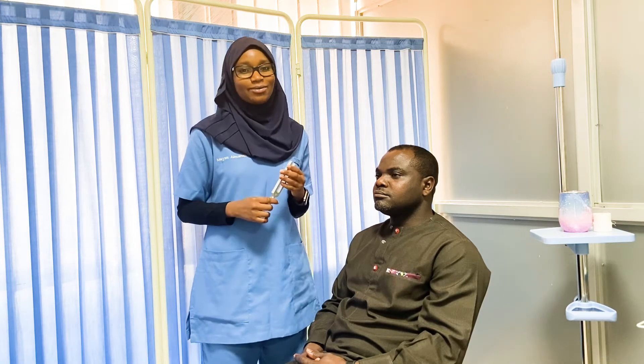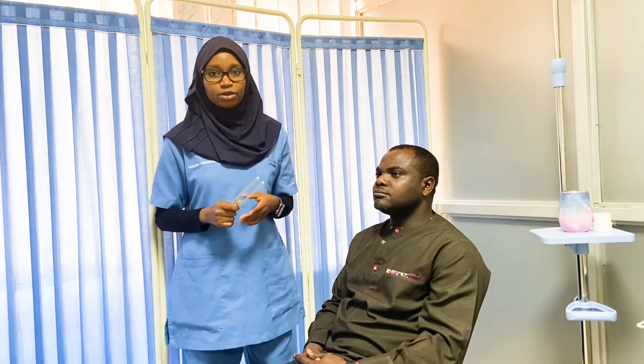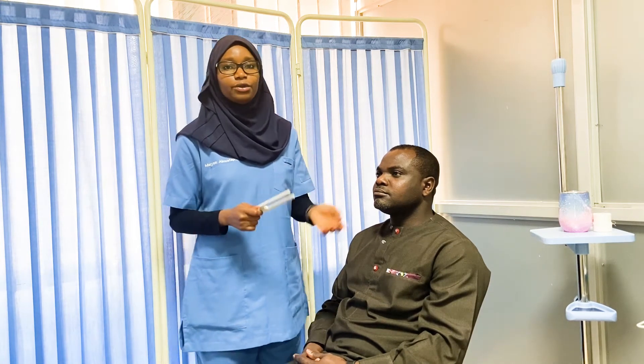My name is Dr. Miriam. In this video we're going to be explaining the Rinne and the Weber test. Both tests are used to test hearing of the patient. They need to be done together and interpreted in the context of each other to get an accurate result. You can't do one without doing the other and expect to get a proper result.